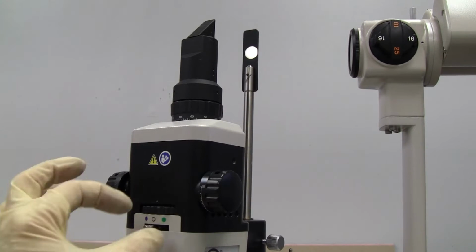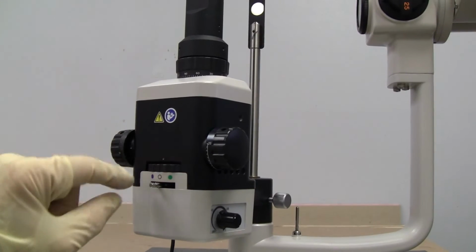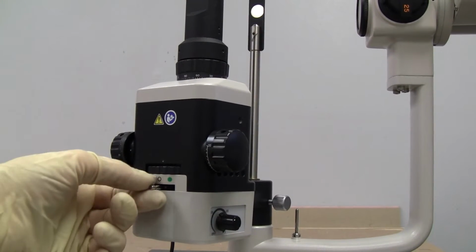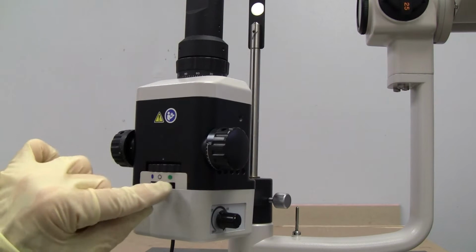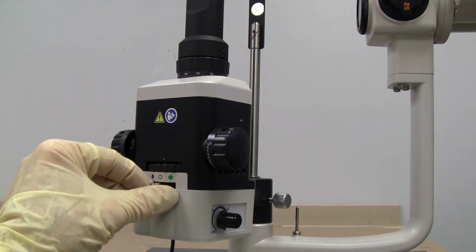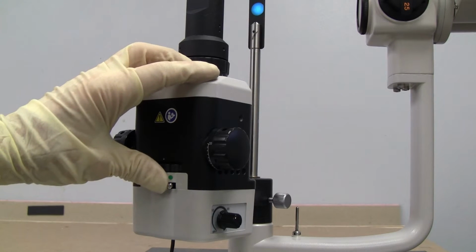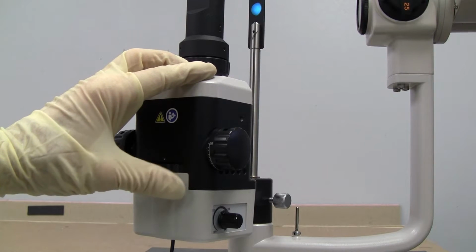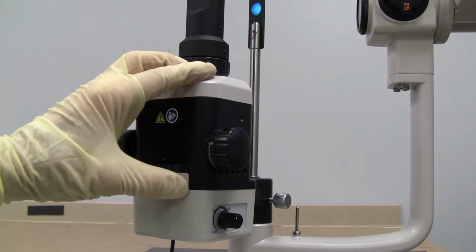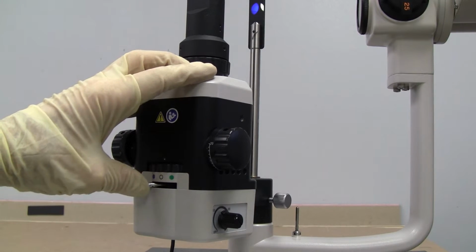And one way we can tell if we're centered and the alignment is that on each end there should be a little extra. It should go all the way to the color and leave a little bit of room. And both sides should have the same amount of space. This has got a lot of space, but if I go back over here, I don't have any space.